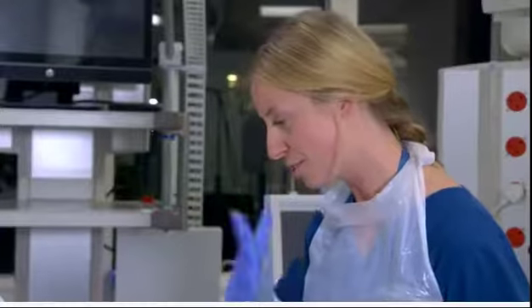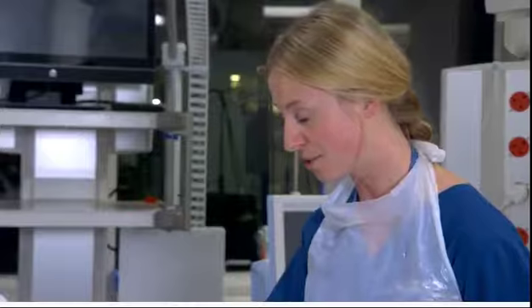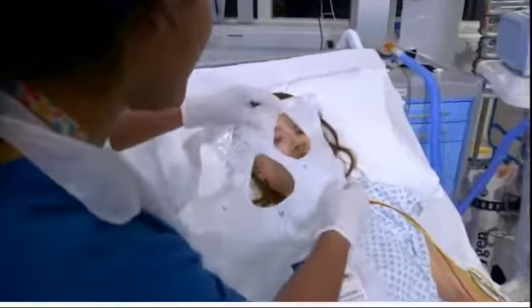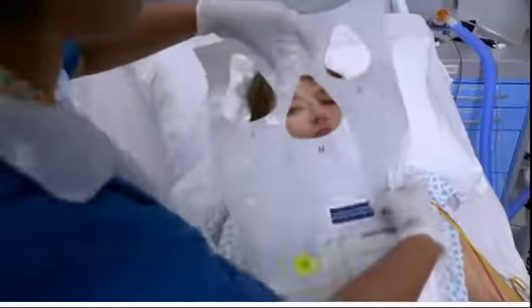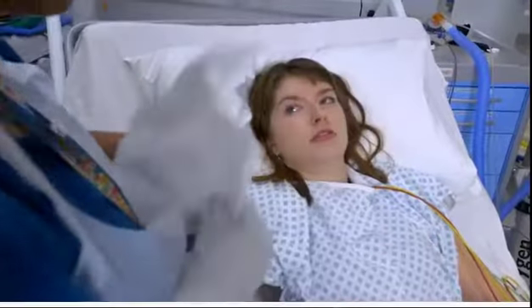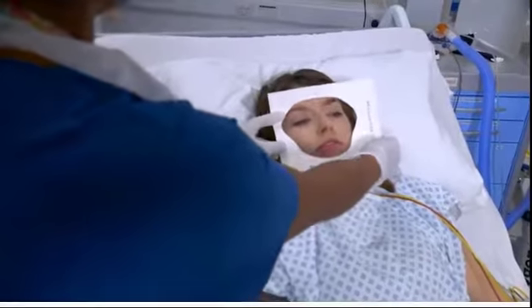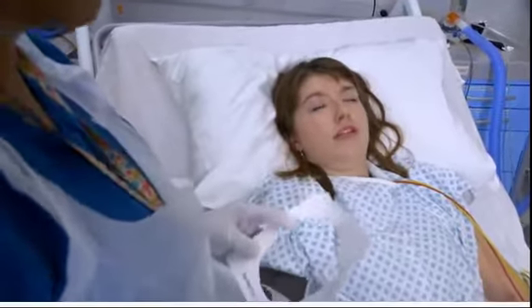We're going to size up a new mask for you today, which is going to help you with your breathing. So if it's okay, Diana will size that up for you, and then we'll get going with the machine. Hi, so I'm just going to size up which is the most appropriate. We'll do the face mask first. I think this looks a bit smaller. I think probably the medium would be the most appropriate. I would also want to check the full face because this is more comfortable. Yeah. I think a full face, large one should be most appropriate for you. Okay? Are you happy? Yeah.